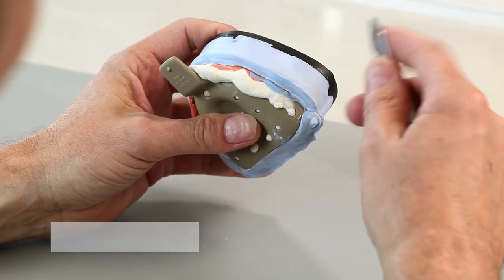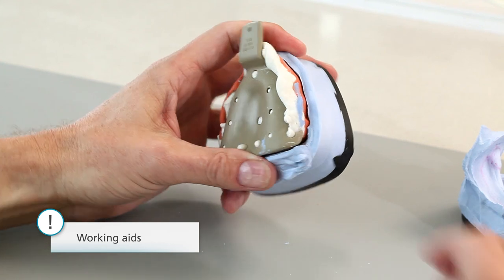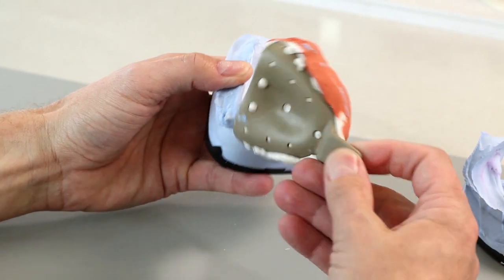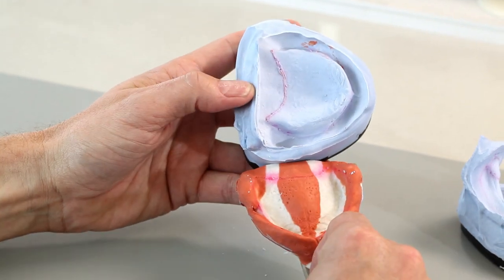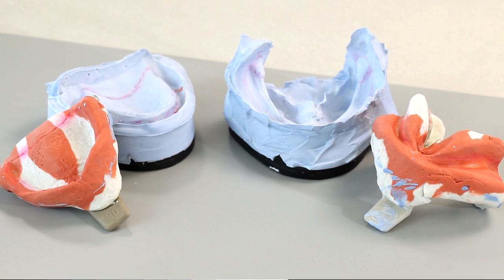Cast the models in dental stone in the usual manner, using the preliminary impressions. After the dental stone has set, carefully remove the impression from the model. Make sure that all the information from the preliminary impression has been accurately reproduced on the model.